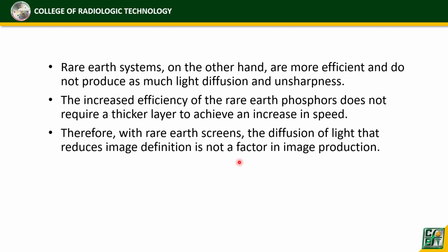Okay? So, dahil sa rare earth systems ay efficient phosphor, so mga rare earth IS ay hindi kailangan na makapal ang phosphor layer. Okay?